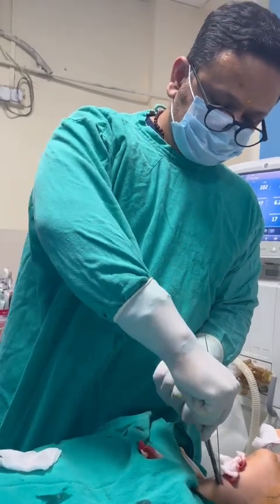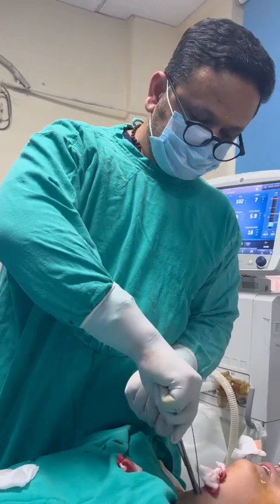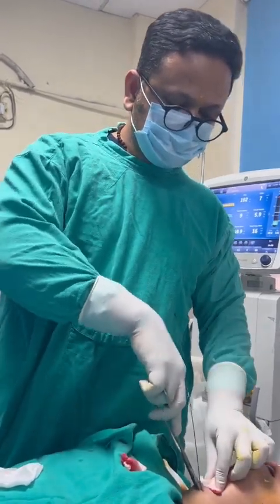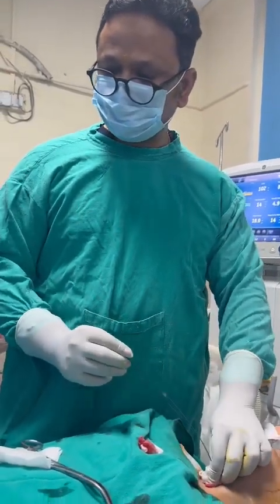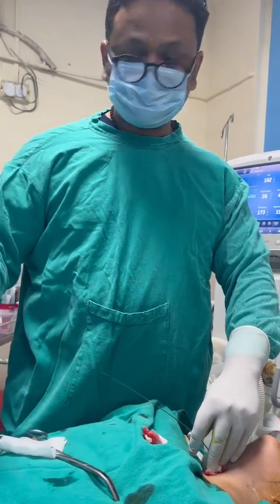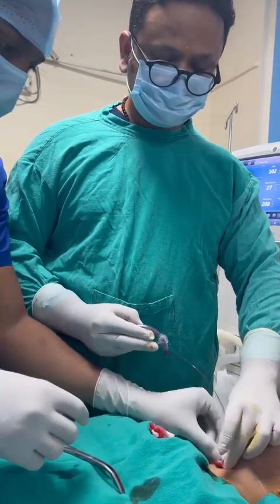To dilate it, how much space? Approximately 1 centimeter, maybe 1.5 to 2, depending upon the size of the tube which you have inside. Where is the tube? 7.5. Blood pressure 153 by 79. Okay, good.